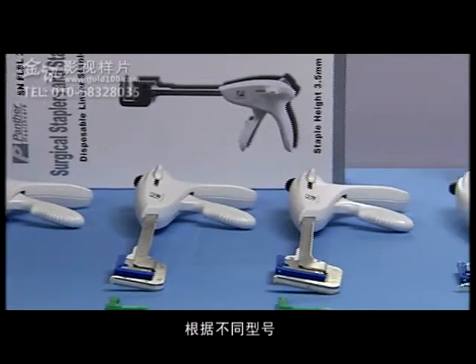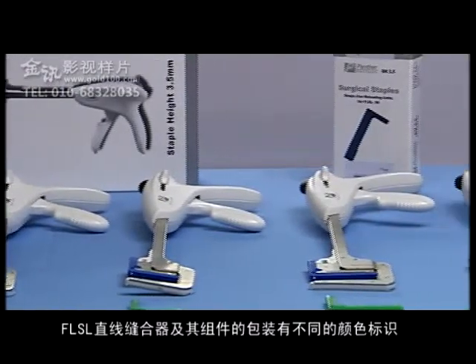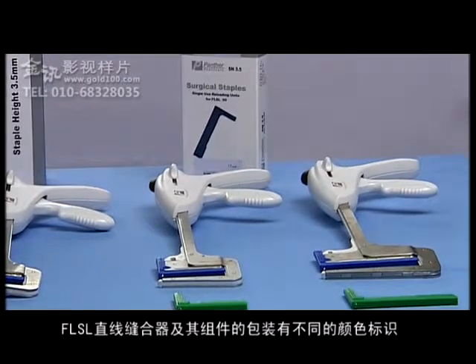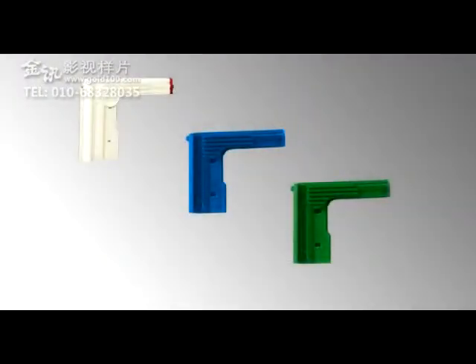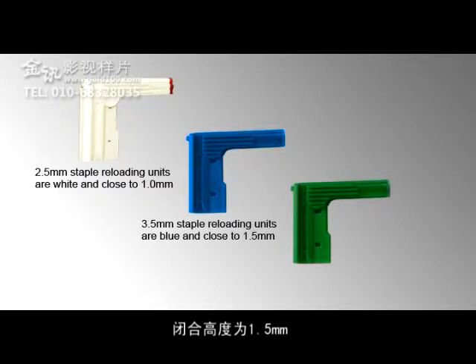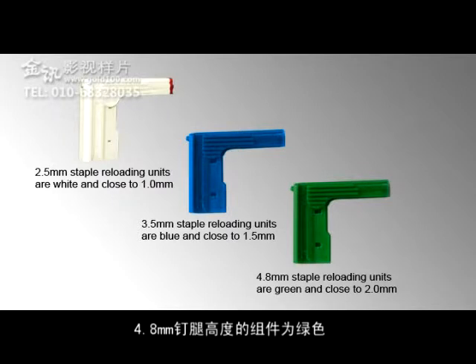The FL-SL linear staplers and reloading units are provided in a blister pack color-coded according to the size of the staple. The following staple closure sizes are estimates. 2.5 mm staple reloading units are white and close to 1.0 mm. 3.5 mm staple reloading units are blue and close to 1.5 mm. 4.8 mm staple reloading units are green and close to 2 mm.